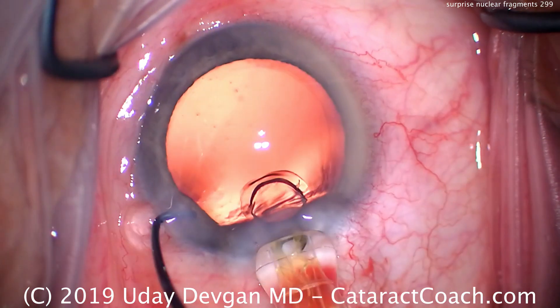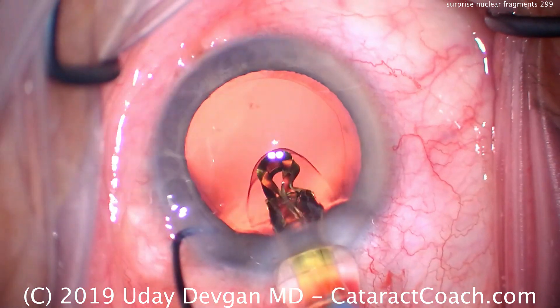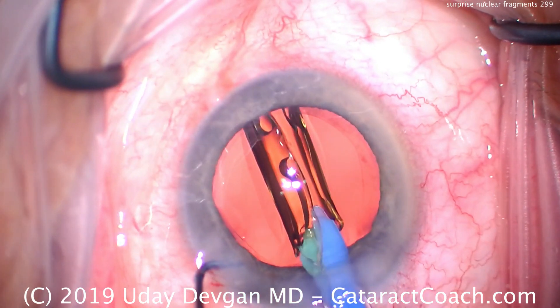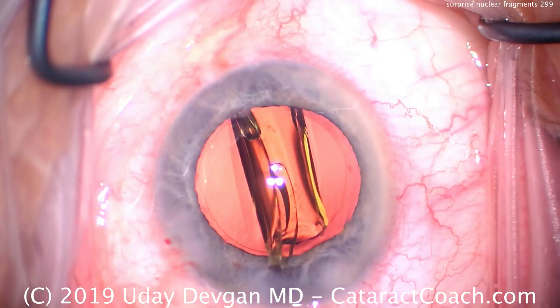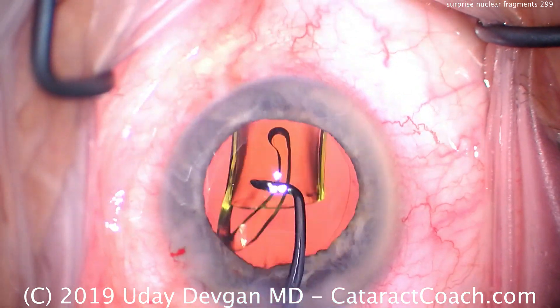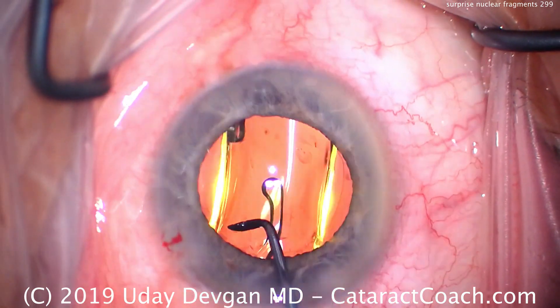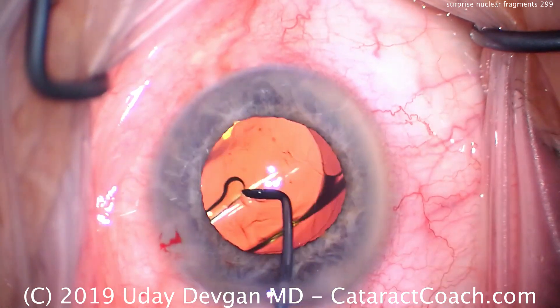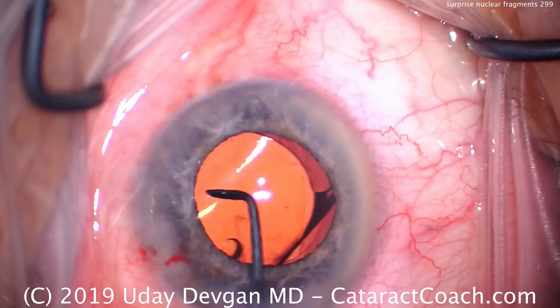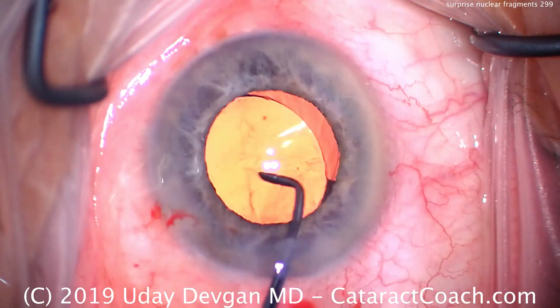We're going to insert our lens coming in here. A single-piece acrylic lens — put that right in the capsular bag, and everything goes as planned. This is a patient where we did phaco chop, our usual technique to remove the nucleus, cleaned up all the cortex quite nicely. Let's rotate it in the capsular bag, get that second haptic to unfold all the way.